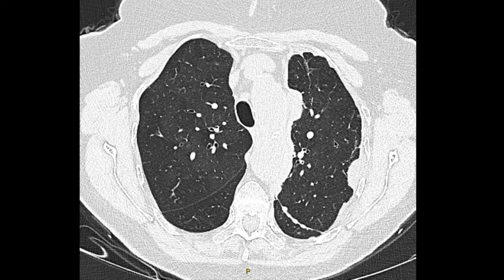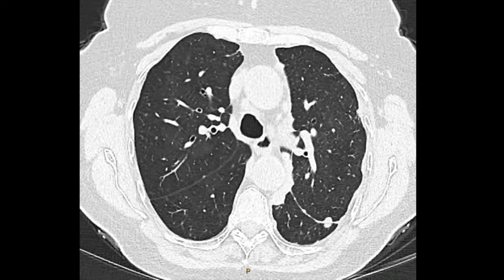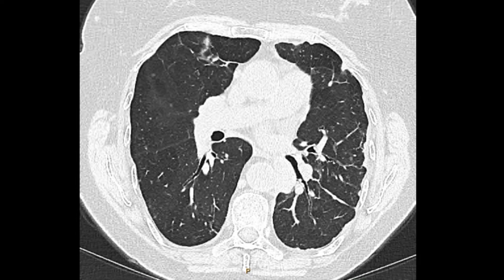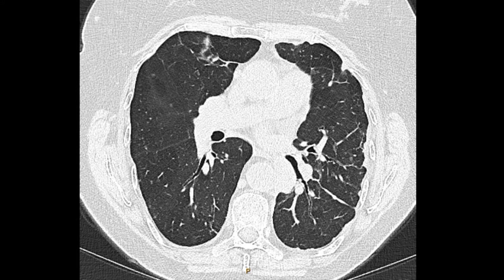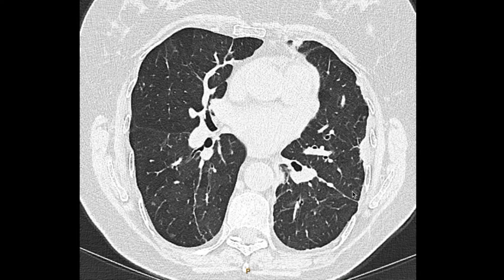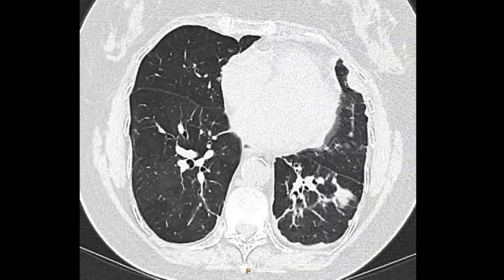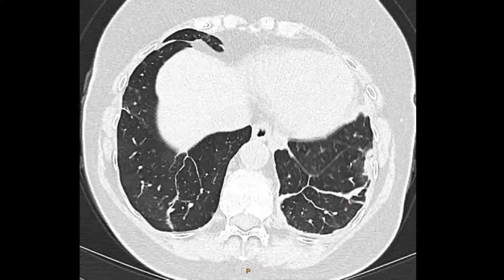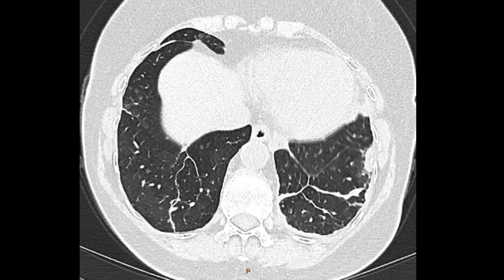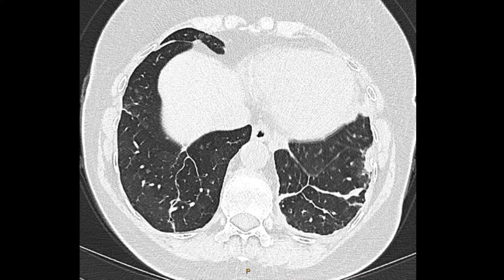There seems to be a bit of volume loss in this left lung compared to the right lung. Here we can see some nodularity of the fissure, and right down at the base of the lung we can see some areas of linear atelectasis. I certainly cannot see any lung mass, and there's also a little bit of atelectasis down at the right base.